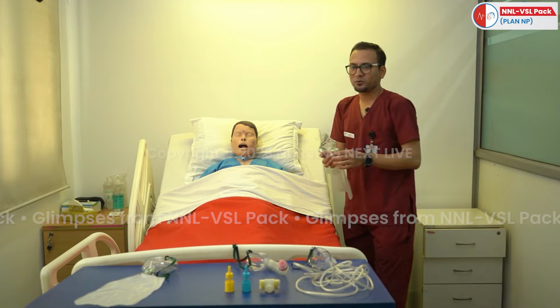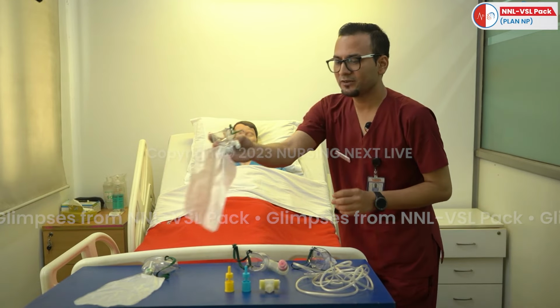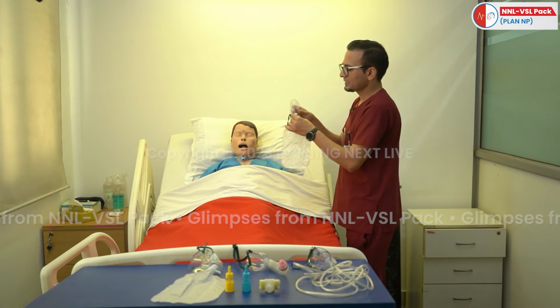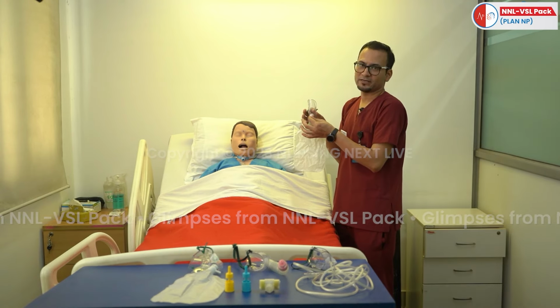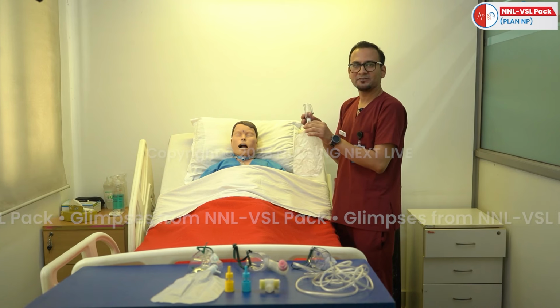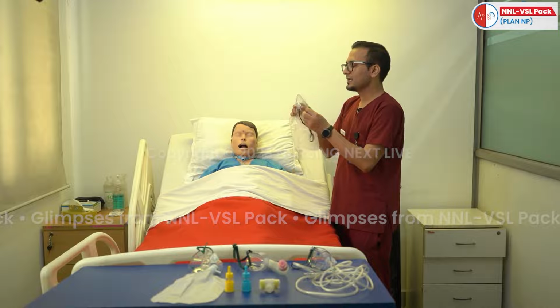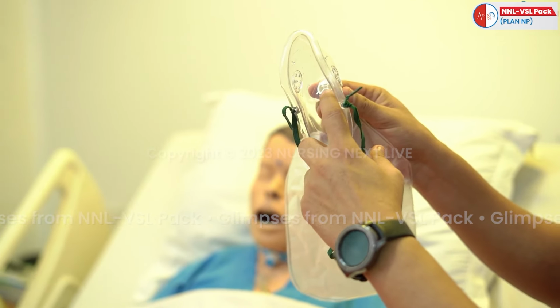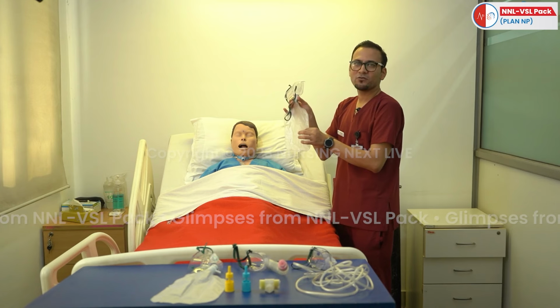Next I am going to show you about the partial rebreather mask. This mask is known as the partial rebreather mask. It is similar to the non-rebreather mask, but the main difference in this partial mask is that you are not able to see the flap. Because there is no flap, there is a mixing of air.